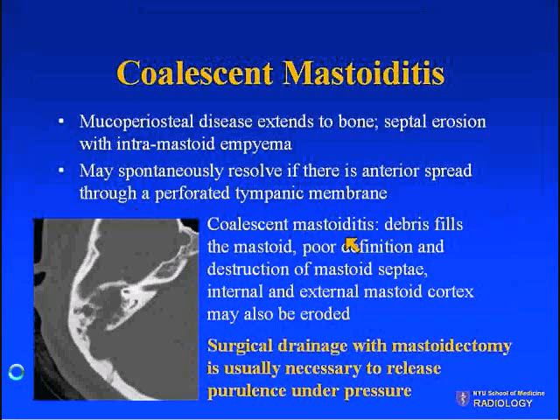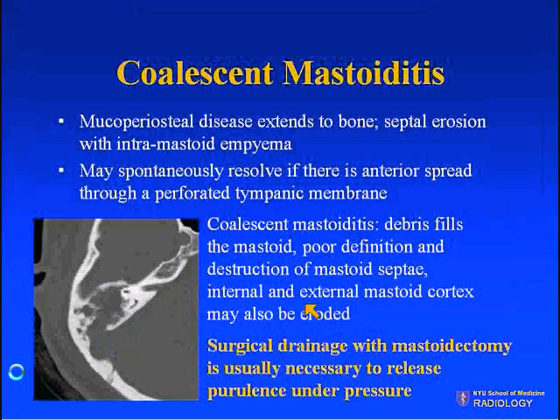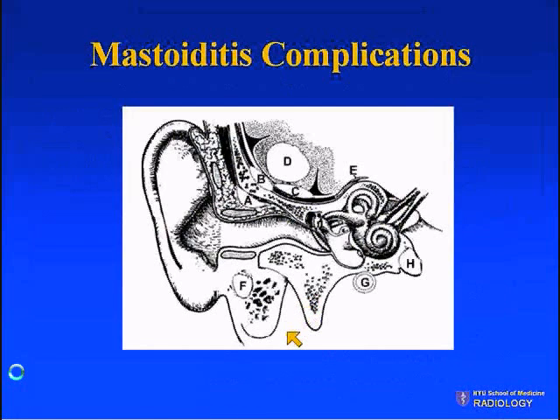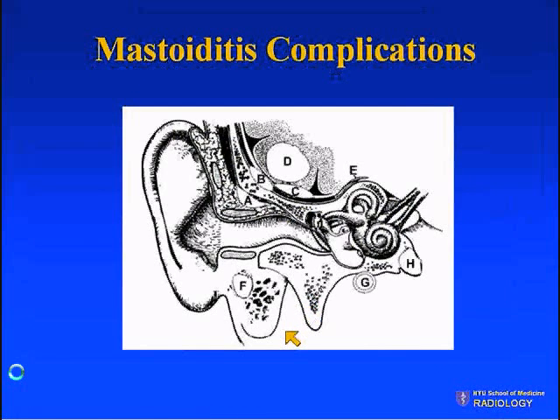When we say coalescent mastoiditis, we're going to see debris filling the mastoid, poor definition, and destruction of the mastoid septa, with destruction of the internal and external mastoid cortex. These patients typically will require mastoidectomy for drainage of the pus.